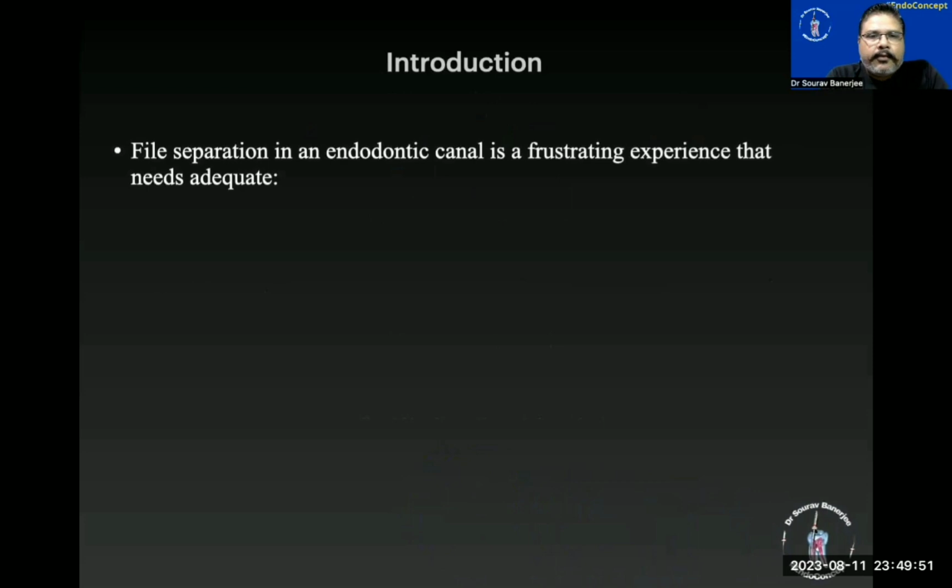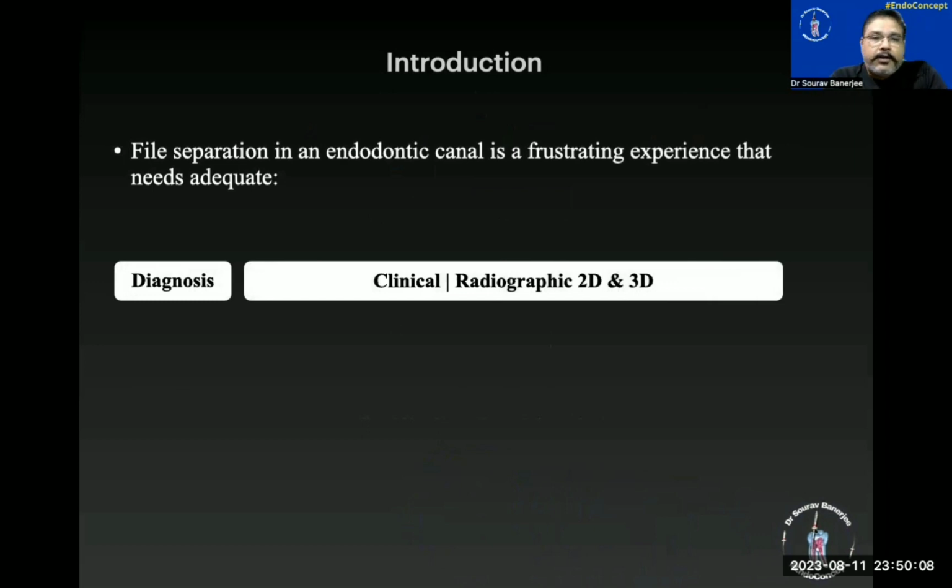First of all, it's quite obvious that whenever a file separates in an endodontic canal, it's quite a frustrating experience for all clinicians. The difficulty is, on one part, how to deal with it, and on the other part, how to delegate it to the patients. So we will be concentrating on the other aspect, how to clinically manage a particular kind of situation that we are going to follow up in this particular case.